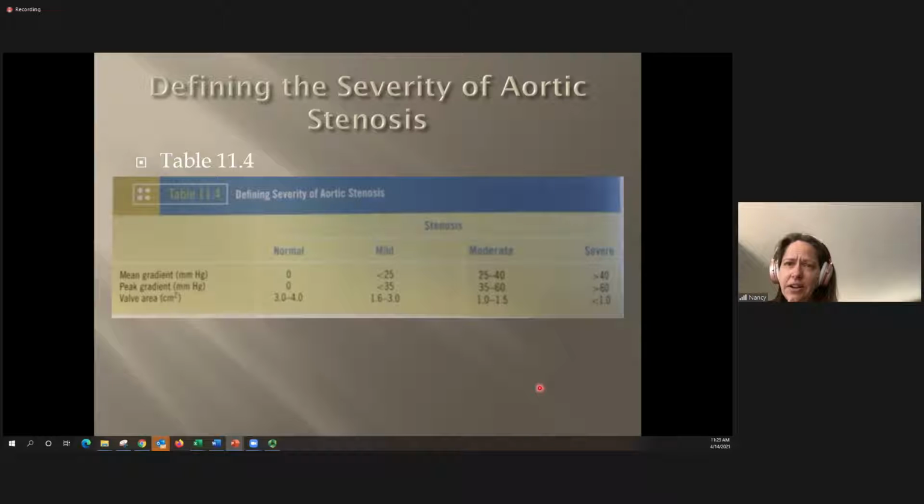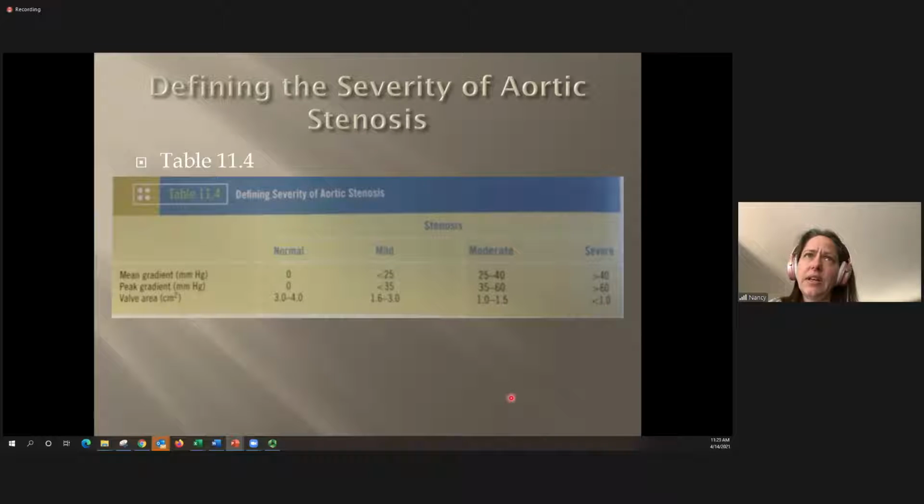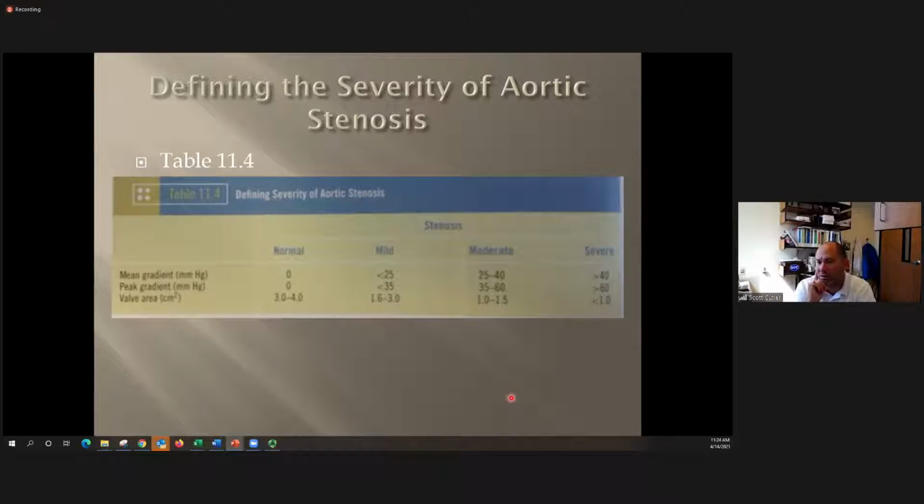Is cross-sectional area the same thing as valve area? Yes. So Michael, when you're thinking that valve area and cross-sectional area are different, they're the same thing? That depends. If you're talking about LVOT, we do a cross-sectional area there, but the cross-sectional area of the valve is the AVA, the valve area. The LVOT cross-sectional area is a different location. So what numbers does that give you differently then? These cross-sectional areas are giving you specifically, when the valve is fully open, what is the hole size?